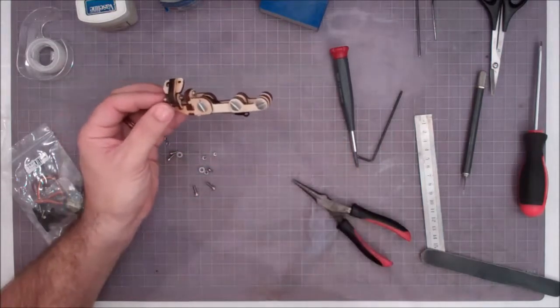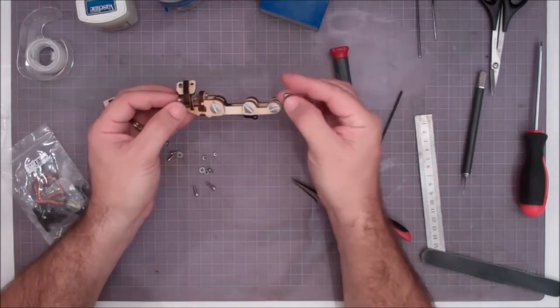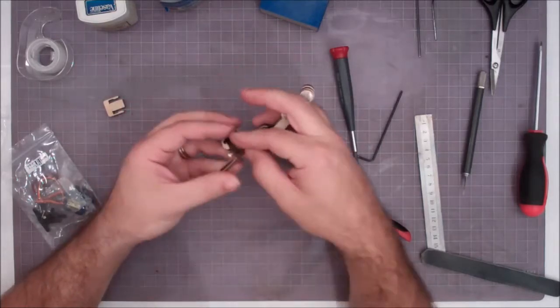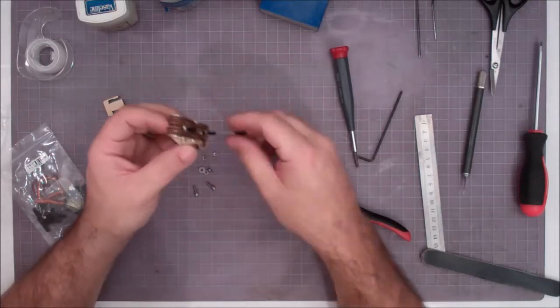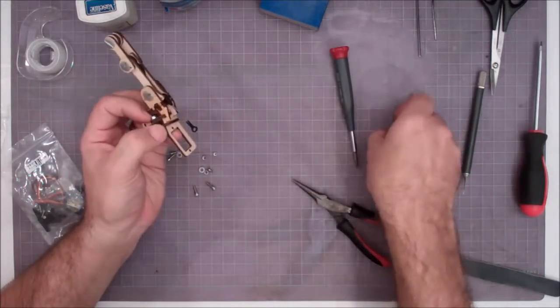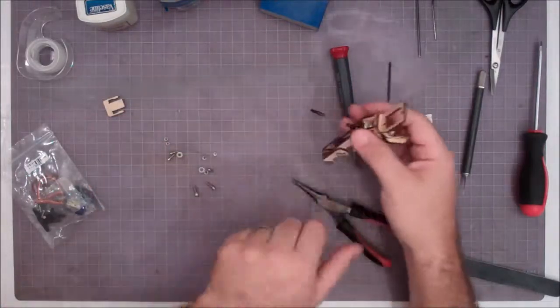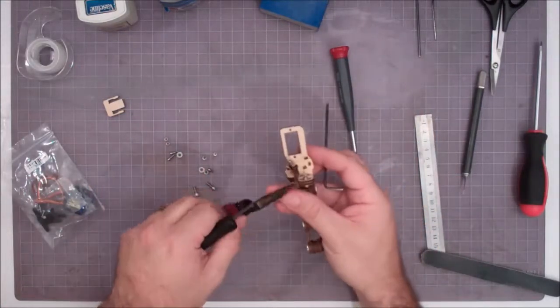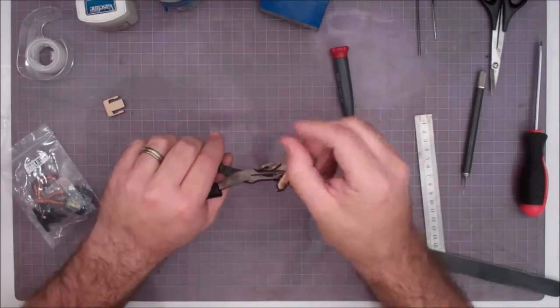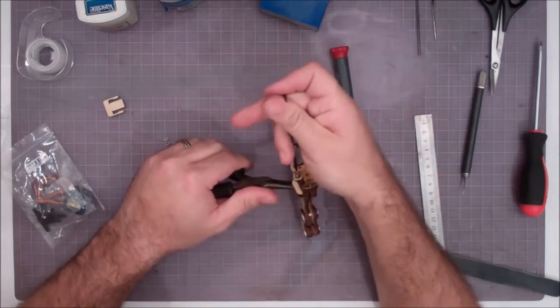And then you'll also find that you have a 440 lock nut. This lock nut is the nut that you want to use on the other side of that bolt. What that does is it allows us to set the tension of that pivot. We can tighten that down until we get it to a nice tension where we can position it if we'd like, but it's still movable. So again, we'll take our little needle nose pliers here, grab that nylock, and screw in this 440 screw, or hex bolt.